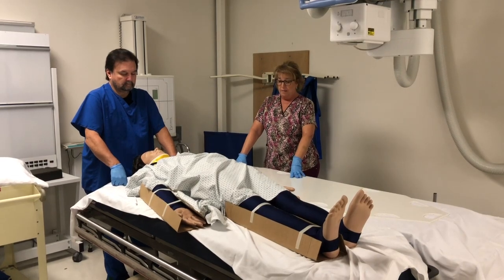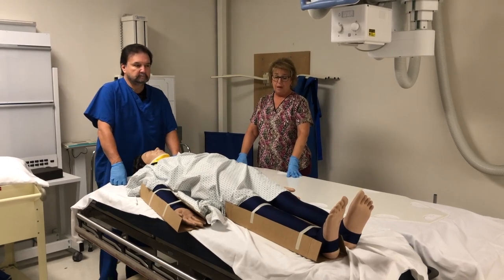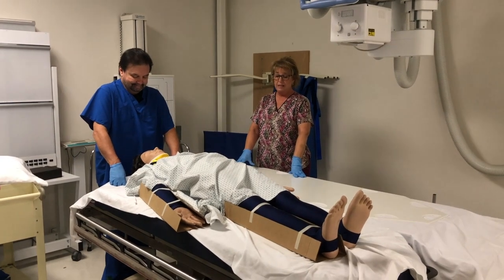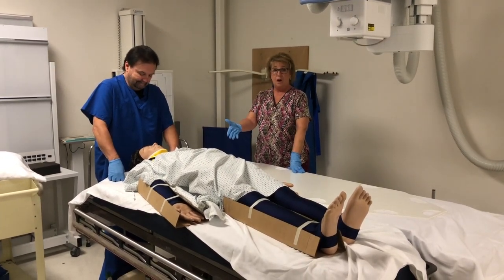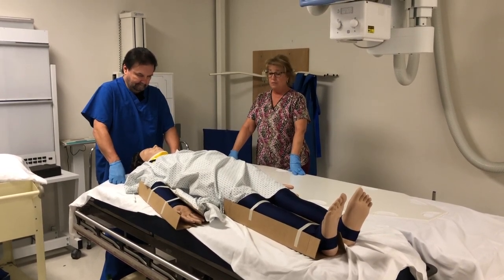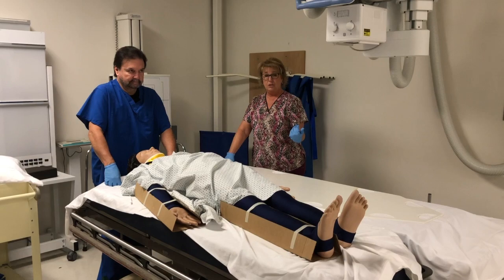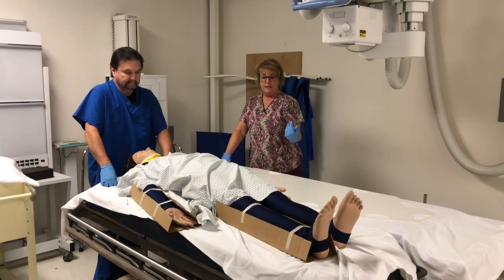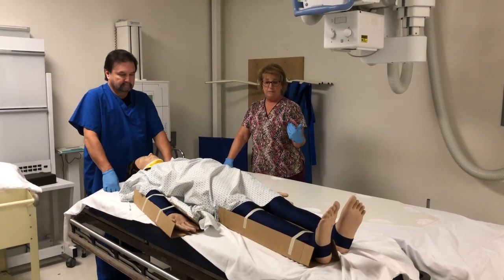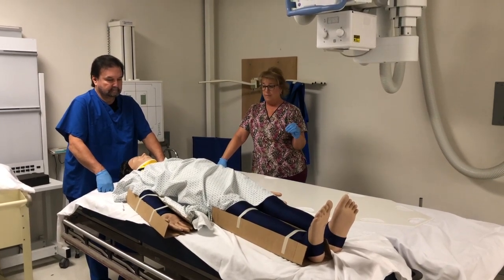And so normally a patient immobilized like this would come in on a backboard. However, they're locked in a cabinet in the hallway and I can't get access to them. So we're going to pretend that she has already been taken off of the backboard, maybe had some portable imaging in the emergency room, and now she's in the radiology department, and we're going to transfer her onto our x-ray table to get additional images of her neck, upper and lower spine, her shoulder, forearm, and tib fib.